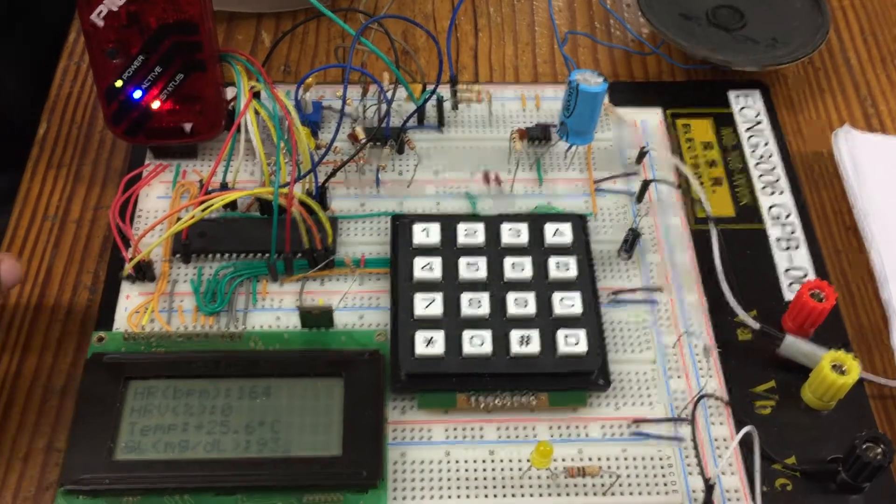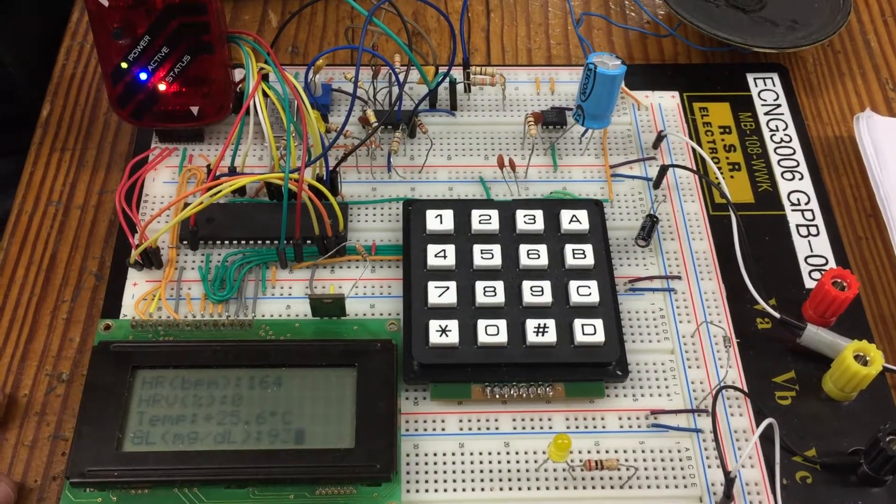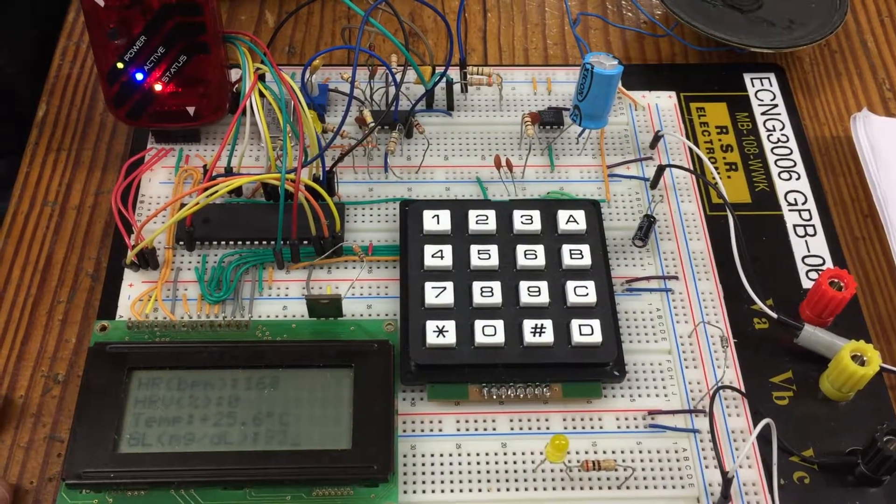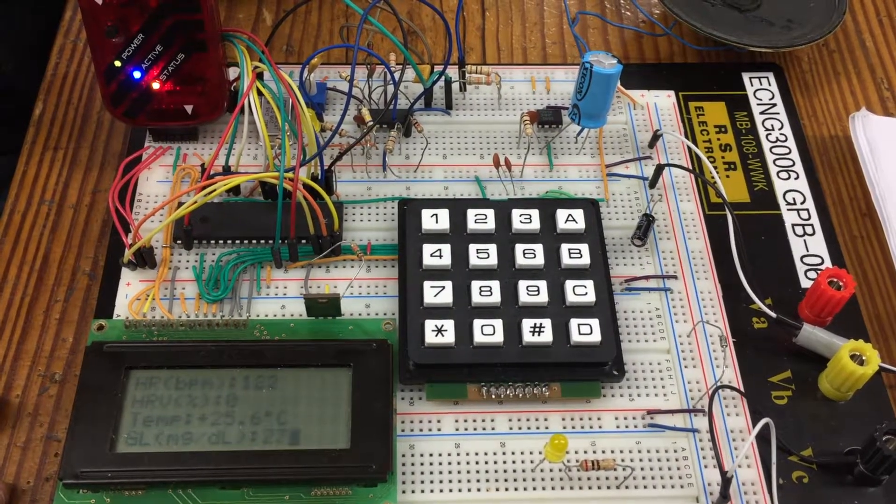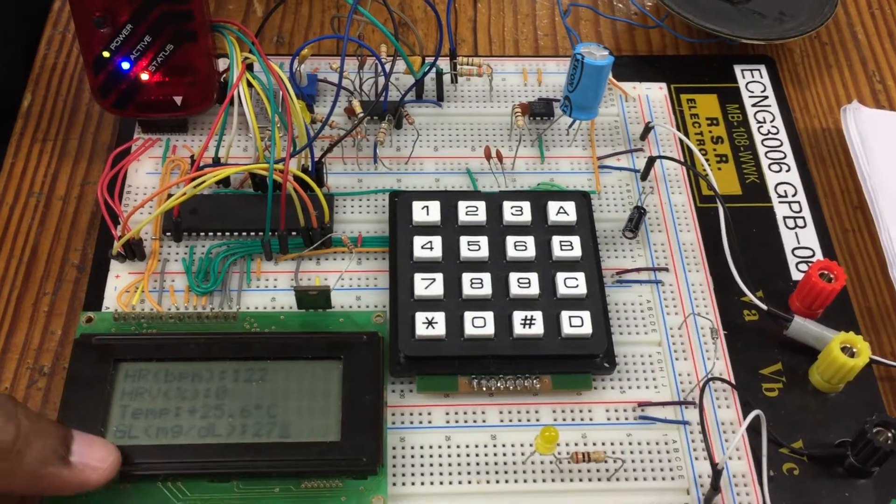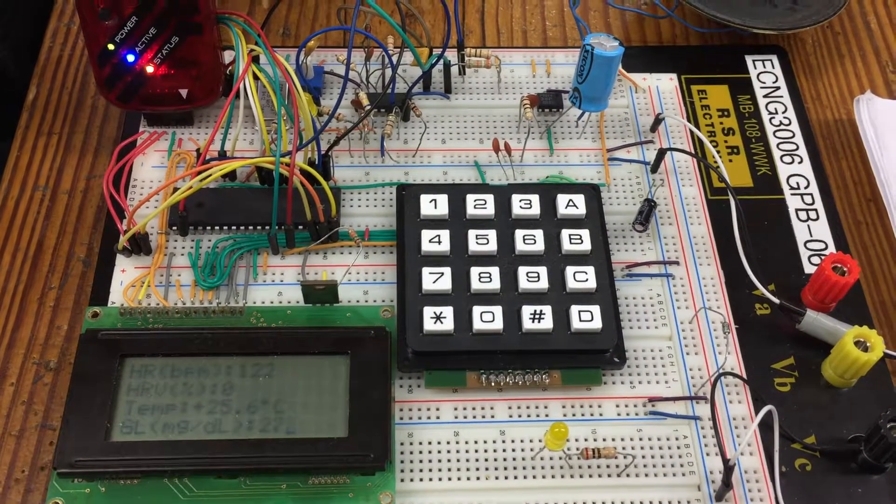And once the heart rate drops below that value, it should turn off the alarm. So you can see that worked as expected. Well now the glucose is below the range so it will sound the alarm.